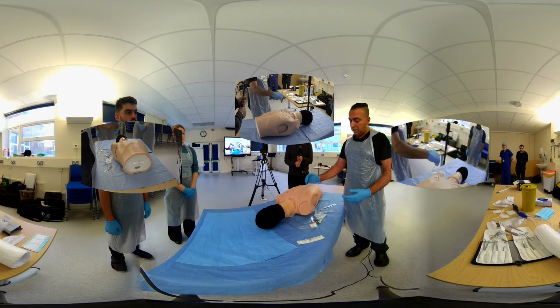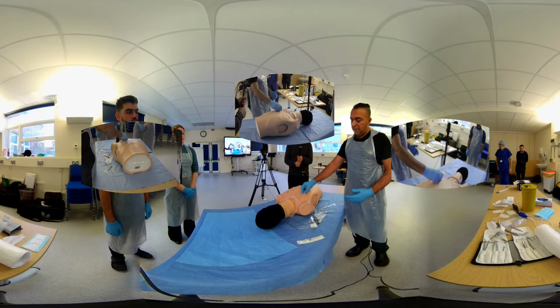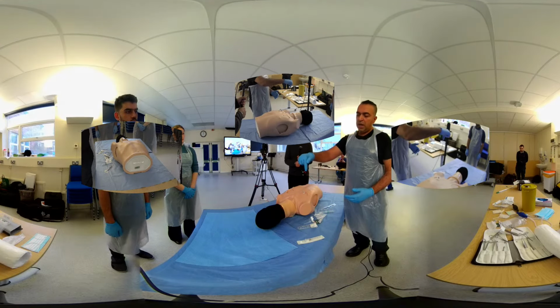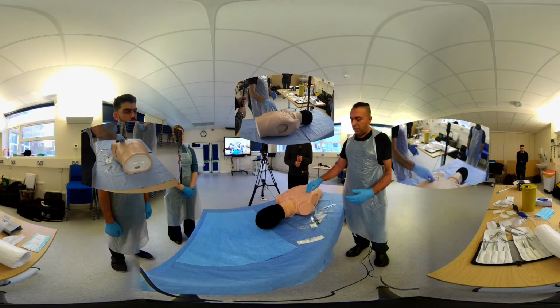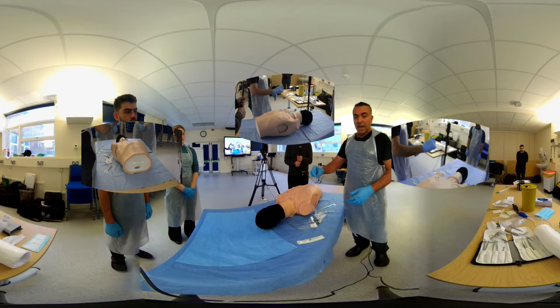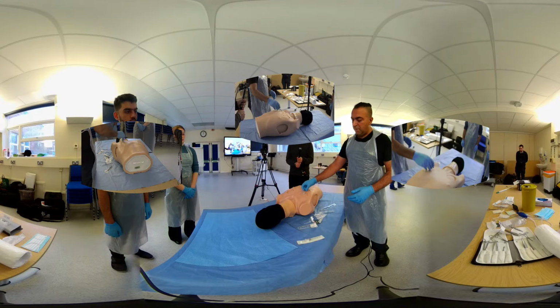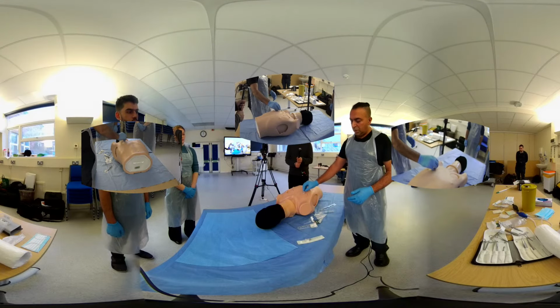So what I do is, as I put the needle in with the Venflon, I actually touch it onto the rib, and I literally almost walk over and then pop it over, a millimetre or so, just over the periosteum. And that's how close you've got to be, because the gap isn't that big, and the gap can obviously be hard to find with different body habitus. So you're going in just over the rib, you've avoided the neurovascular bundle, you've got your diagnosis.